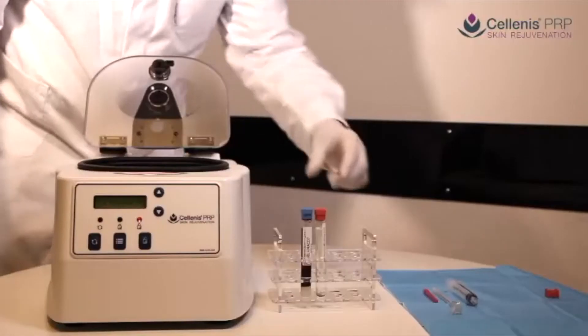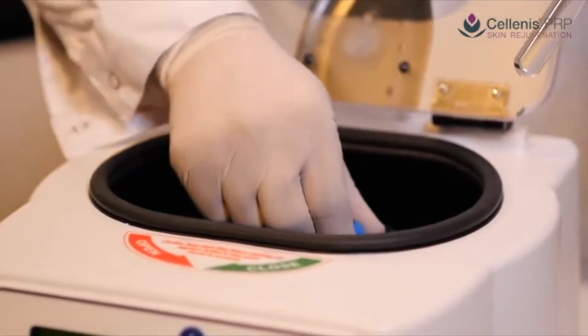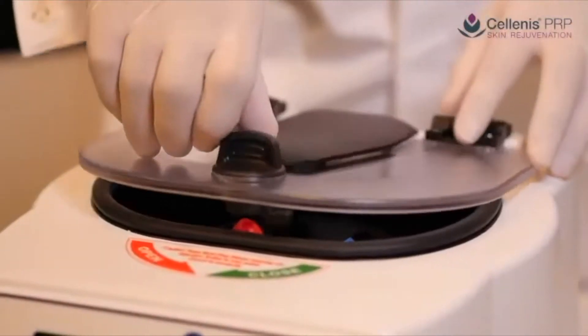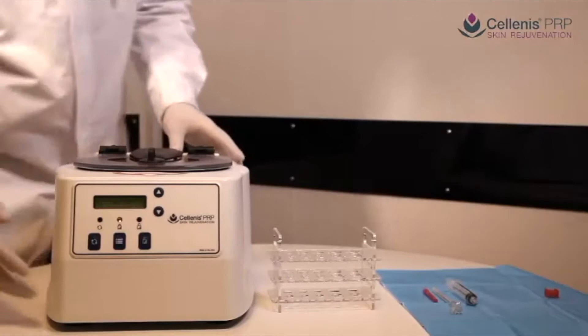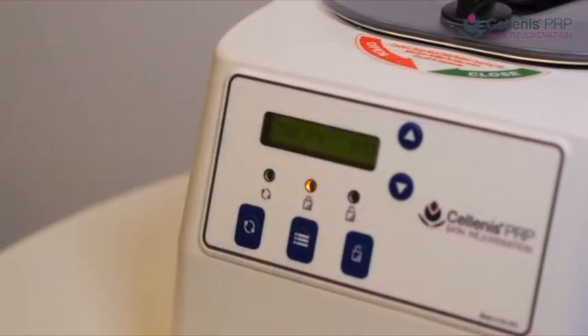Solanus PRP is centrifuged at 1,500 RCF. The speed or revolutions per minute required to achieve 1,500 RCF will vary according to the size of the centrifuge rotor. Ensure your centrifuge can show the RCF reading and do not follow the RPM reading only.